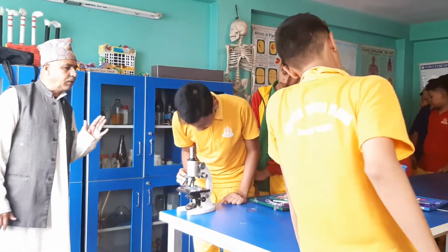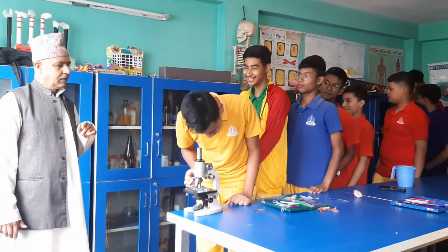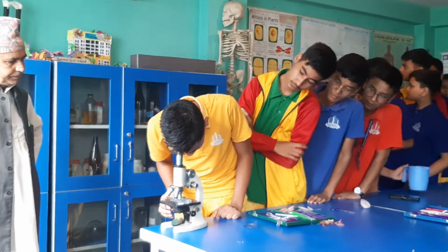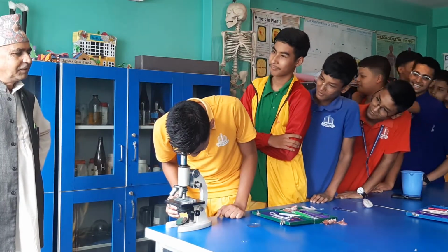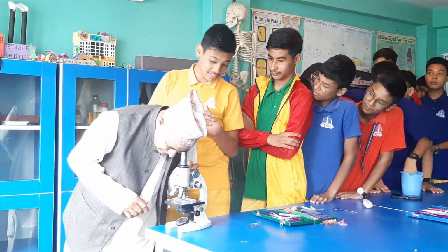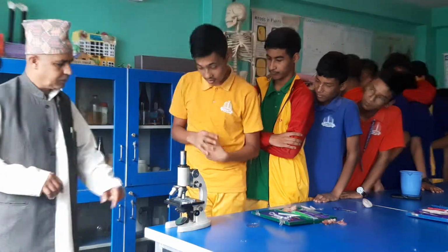First you see what, just check it. Use only one eye. Whether you are able to see something or not. If not seen, then say, sir, I didn't see anything. If seen, then what you have seen, you have made. Black only. Then what you have to do, you have to move this forward and backward.